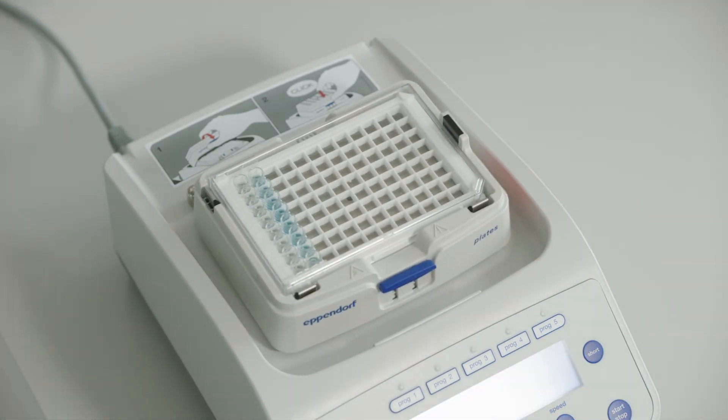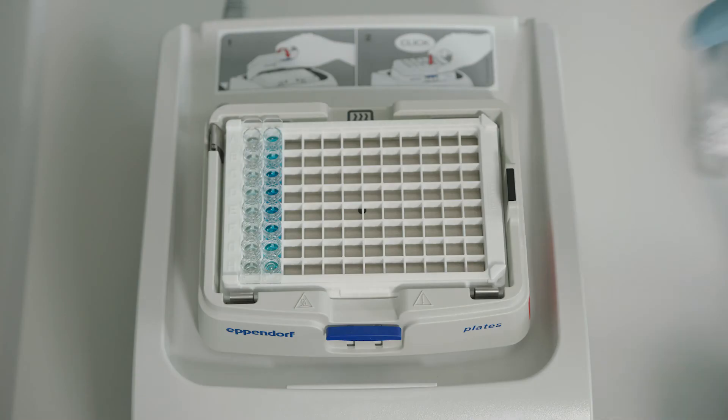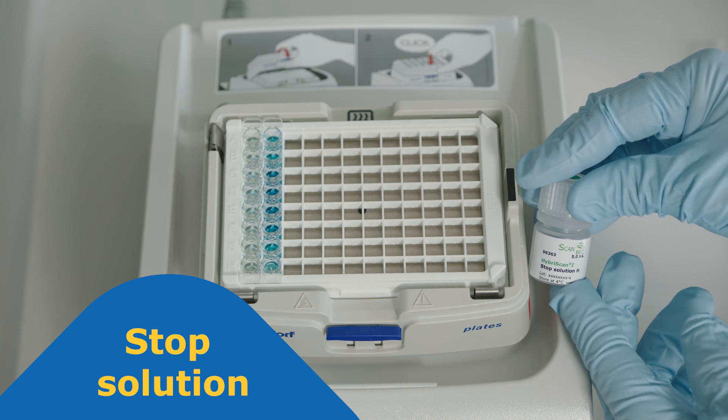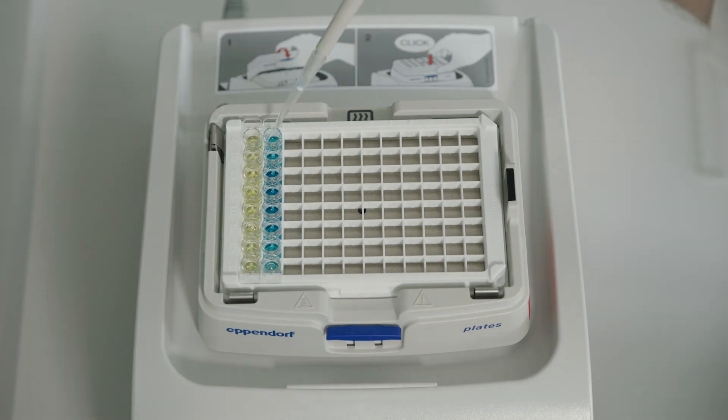The enzymatic reaction is stopped by adding a stop solution. This turns the color of positive samples yellow. The intensity of the color is proportional to the concentration of organisms in the sample. If a prior enrichment step was performed, it is of course no longer possible to quantify the microorganism concentration in the original food sample. However, detection, confirmation, and identification can nevertheless be performed.